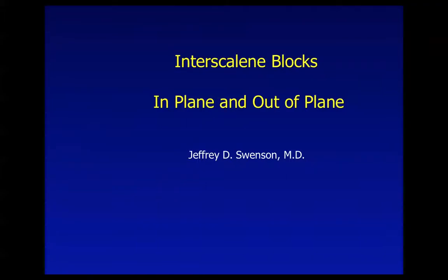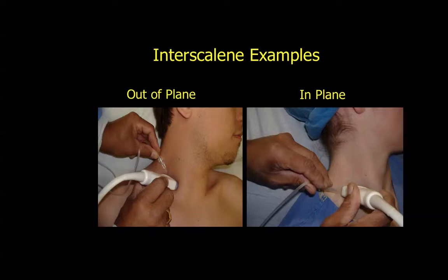We're back talking about interscalene blocks. We'd like to give you some examples of in-plane and out-of-plane approaches with actual ultrasounds. Before we do this, we'd like to review.